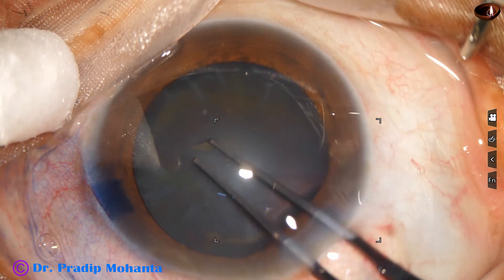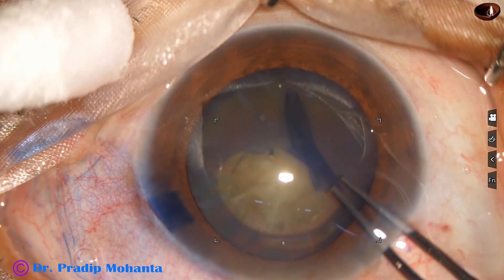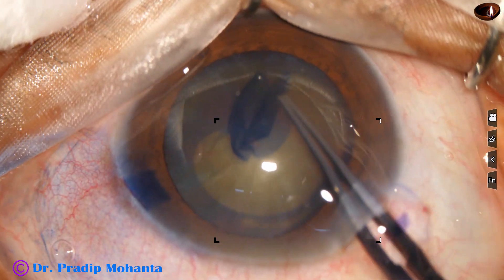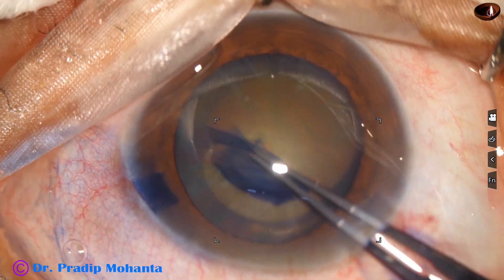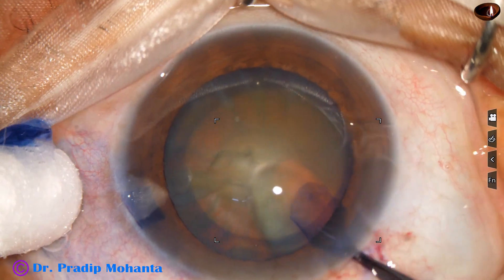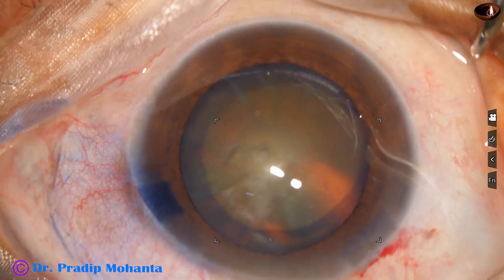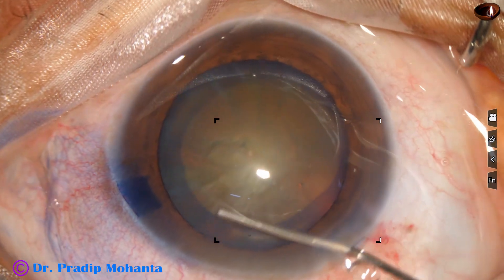Now capsulorhexis is done. The anterior capsule is torn at the center and a capsular tag is raised. This is guided all around to get an adequate sized rhexis. In this case, the rhexis tended to go to the periphery at 9 o'clock, but it could be retrieved.